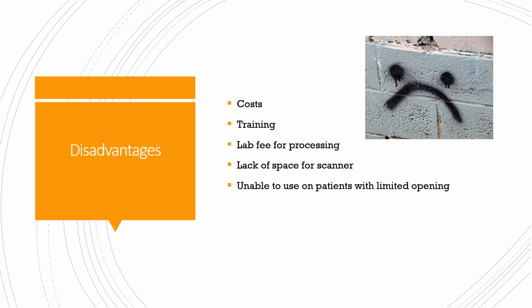Disadvantages are going to include initial costs. The equipment is a little pricey, but keep in mind that you are getting rid of a lot of materials that you're using for traditional impressions. It does require training for the team. You do need training on how to use that equipment so that you're able to then educate the patients and use it on the patients daily.